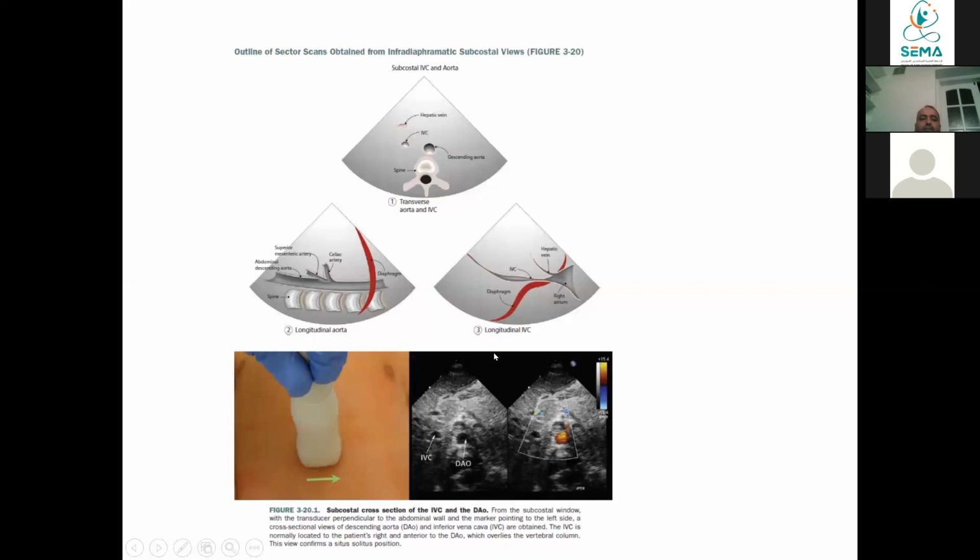So how to differentiate between them? The inferior vena cava is collapsing with a thin wall. And it is not the color. The color in the color Doppler or the ultrasound, if it is blue, it is not necessarily a vein, and if it is red, it is not necessarily an artery. If it is red, that means the flow is coming toward the probe, and if it is blue, it is away from the probe, just like the flow of the blood.